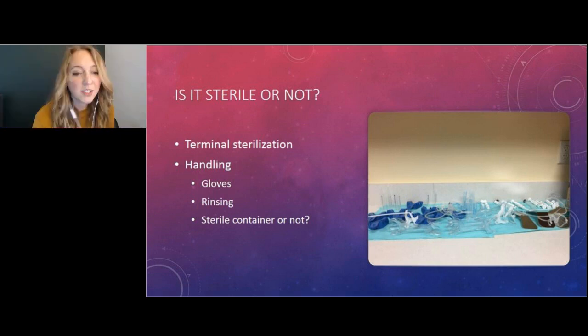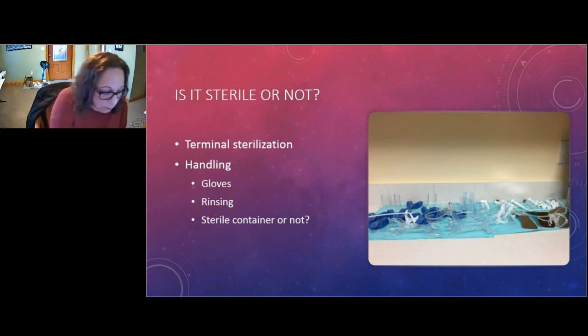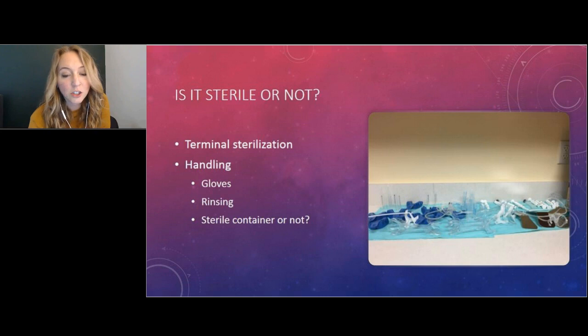All right, this next question says, how can I explain to my peers in my dental office that an instrument reprocessed by cold chemical sterilization is not truly a sterile practice because the items are not packaged and therefore exposed to contaminants? I get it, but how do I express that and get the peers in my dental office to understand that as well?